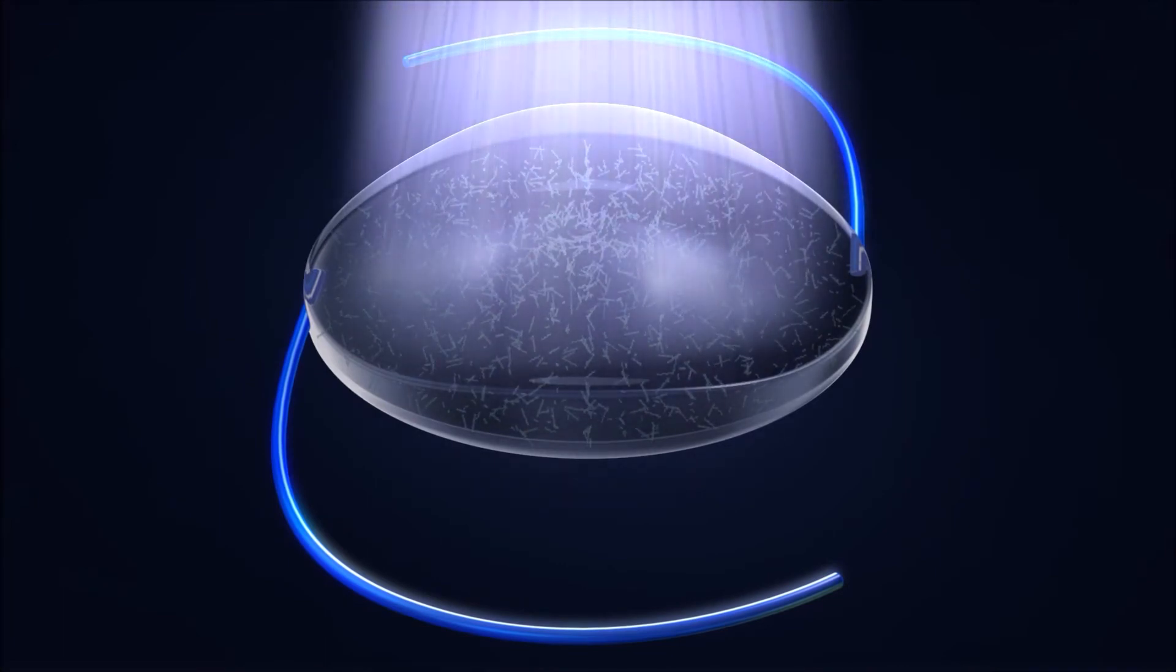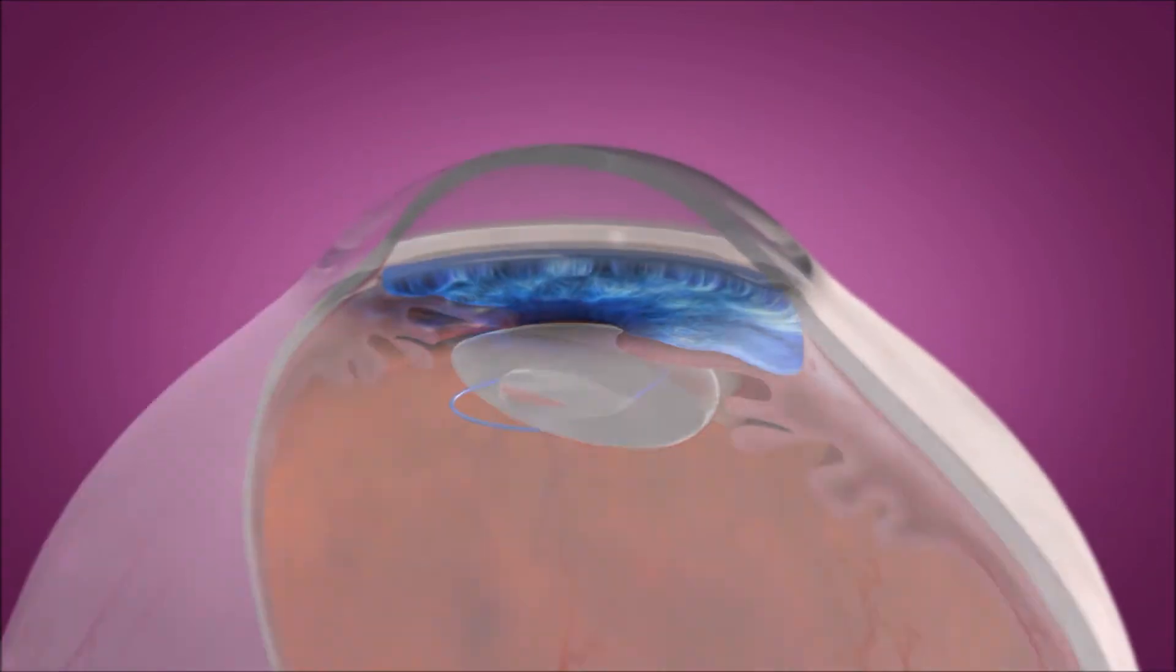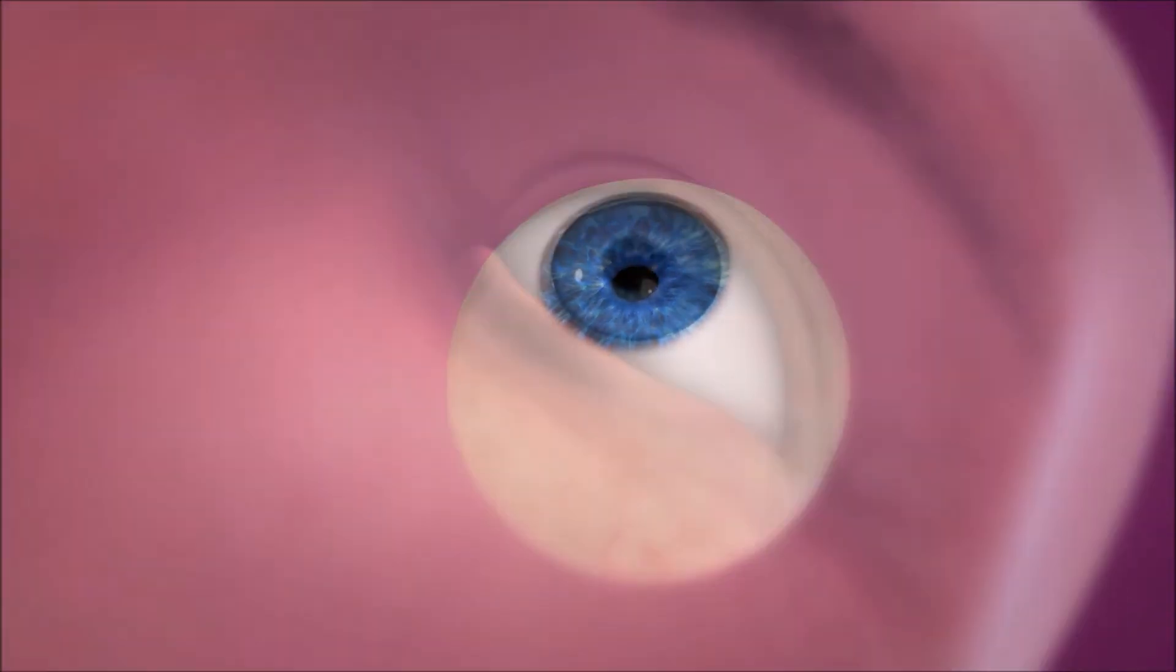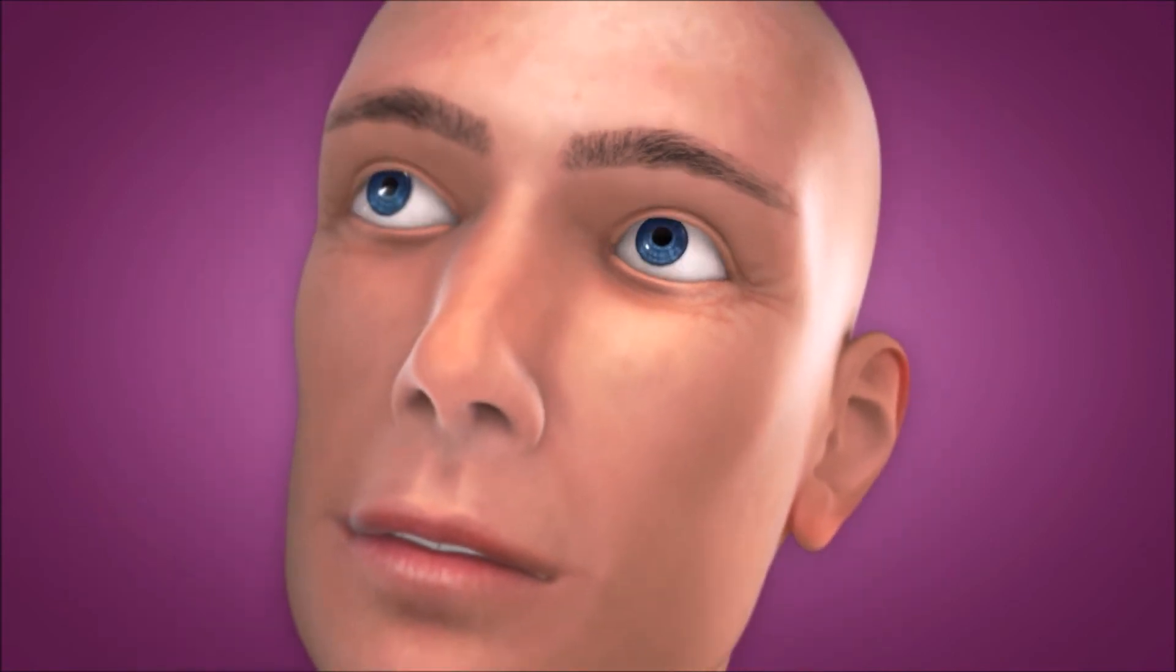RxSight's light adjustable lens enables cataract surgeons to precisely reshape the lens based on the exact amount of visual correction and optimization needed to achieve the desired vision after cataract surgery.